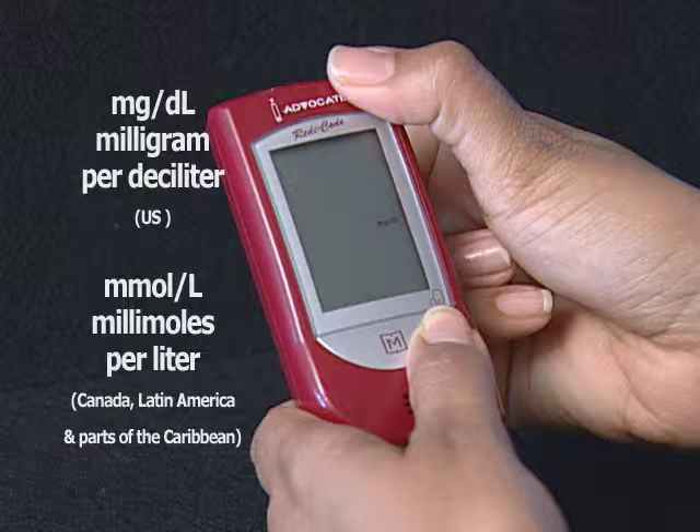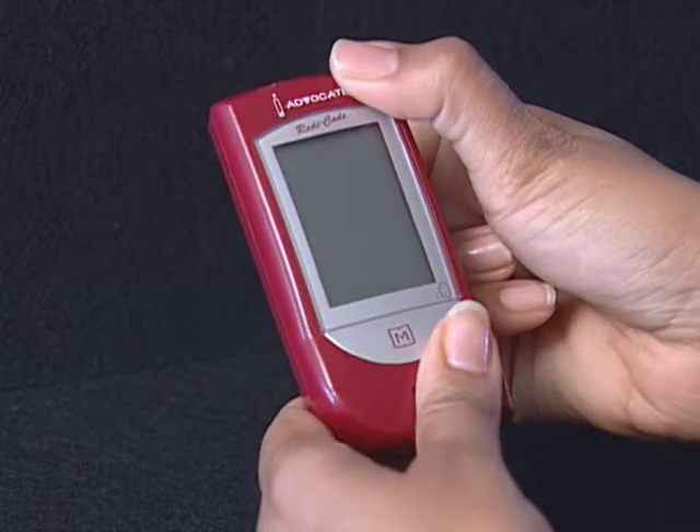Millimoles per liter is the standard unit in Canada, Latin America, and parts of the Caribbean. Press and release the M button to select the unit of measurement you want to use. Press the Set button and then the current unit of temperature flashes.